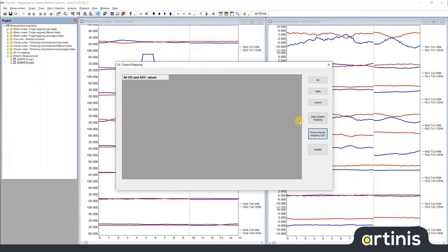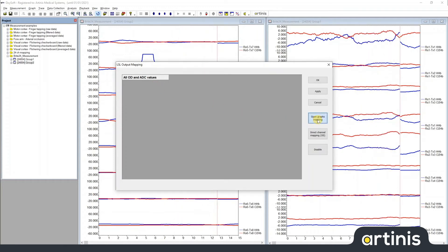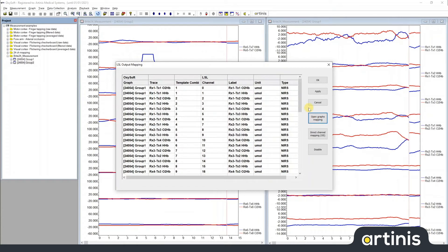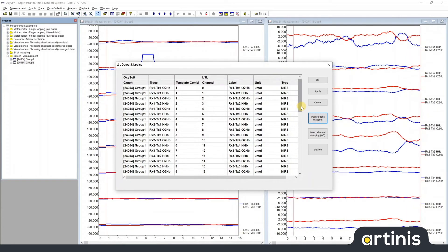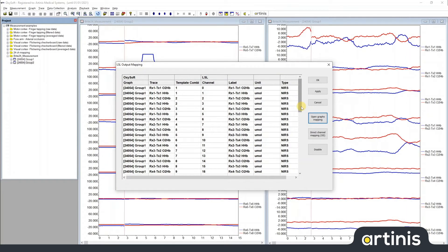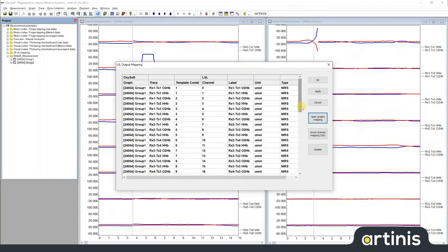The second option is so-called open graphs mapping. When you select this, you will stream the data from any currently open graphs in your measurement.